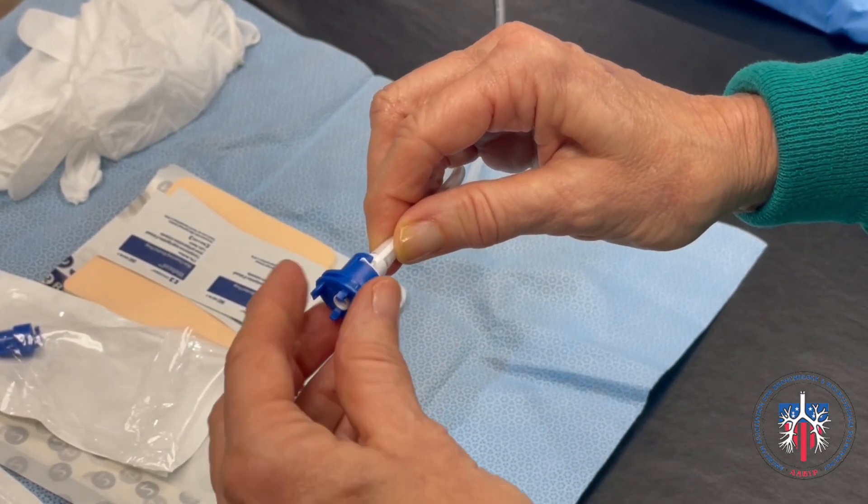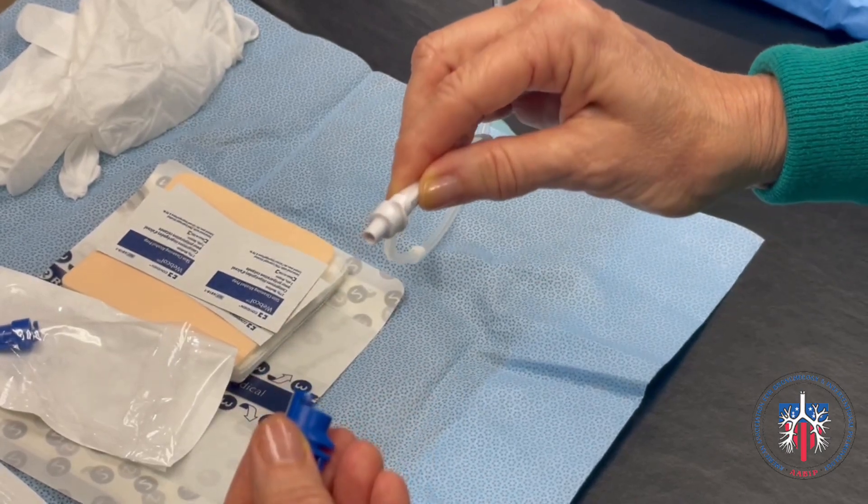To remove the adapter, simply twist it in the opposite direction and pull the adapter off.